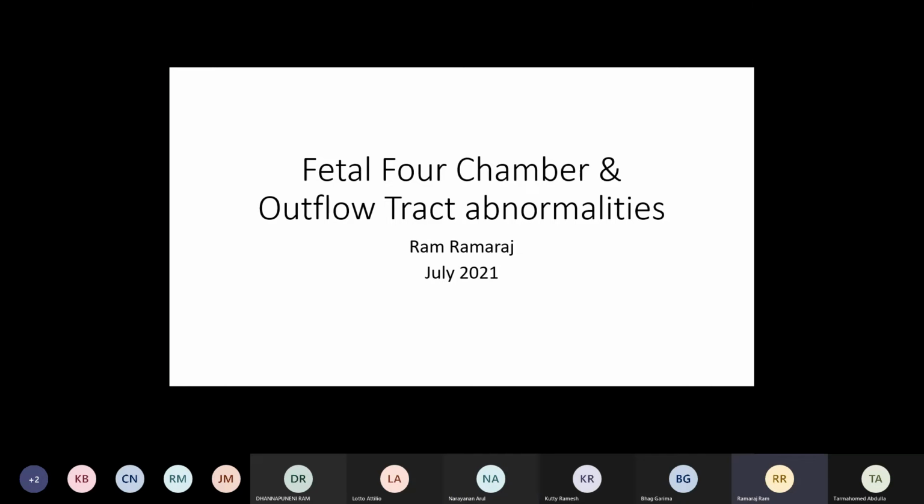That's a scenario I think we have discussed a few times, Arul. It is not widely practiced everywhere at the moment, but MRI has a definite role in very tricky scenarios. At the moment in Liverpool Women's, it's done for other problems, for example CDH, lung pathology, or cranial pathology, where we ask them to look for additional things. But cardiac MRI is not done in Liverpool. If you go to St George's and the Evelina, they're doing more on a research basis.